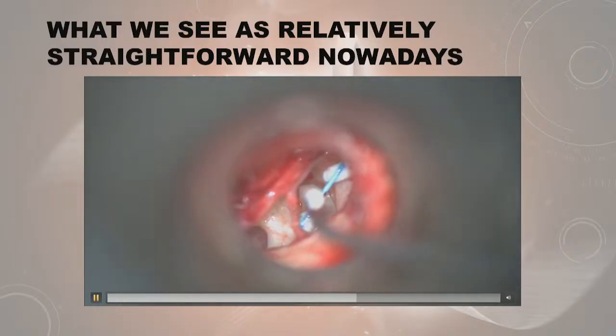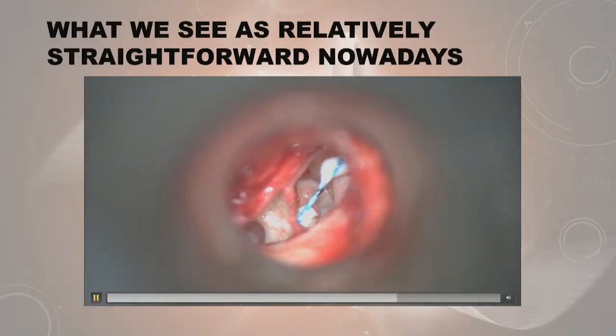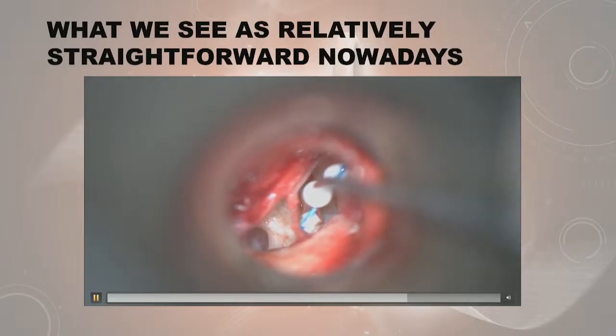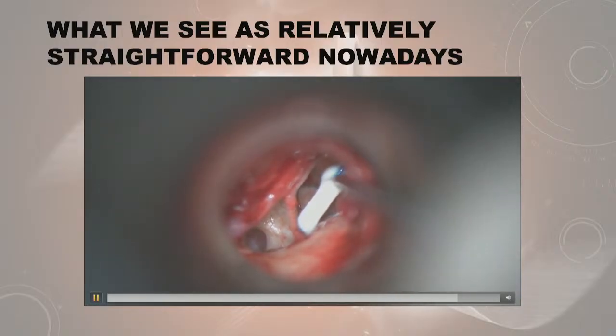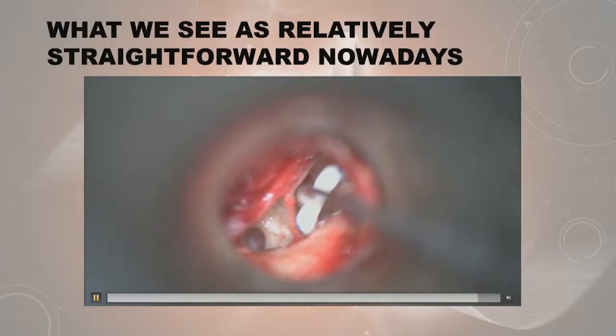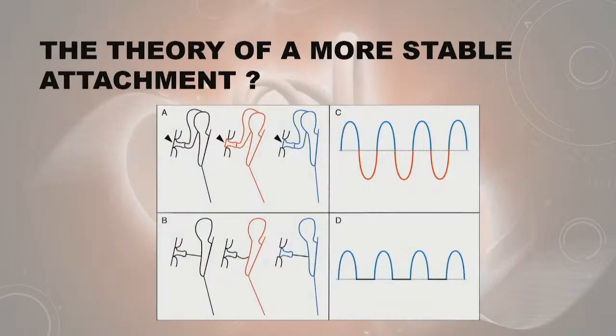So once I've let that set a little bit, I go with another mix, put that on again, just give it a little bit more, and then basically we now use that as our core, because now we can actually direct the cement along that core and put a nice incus-looking structure in place. Within about 5 minutes this is hard, and by 6 minutes it's fully solidified, and you can then go on with the rest of your surgery.